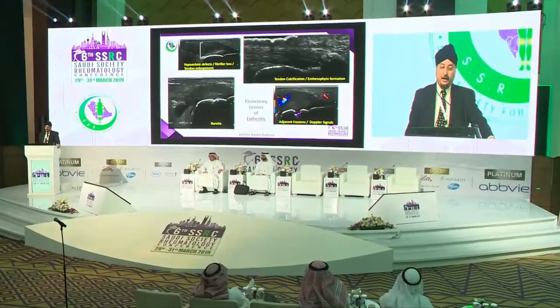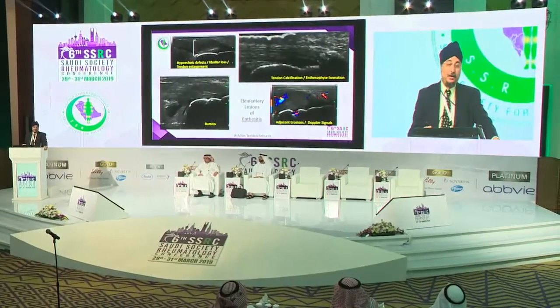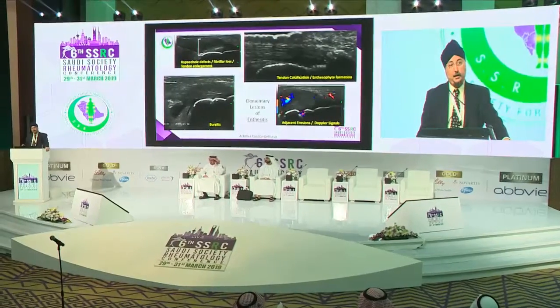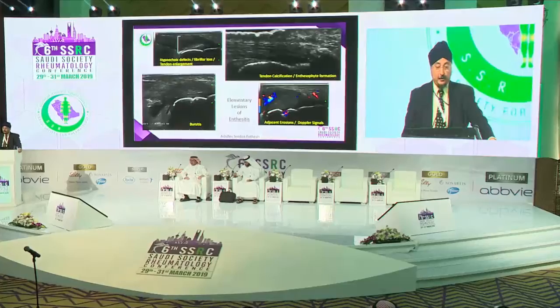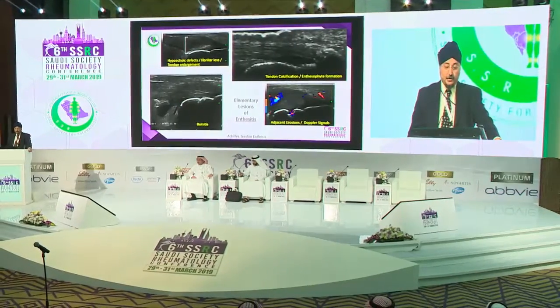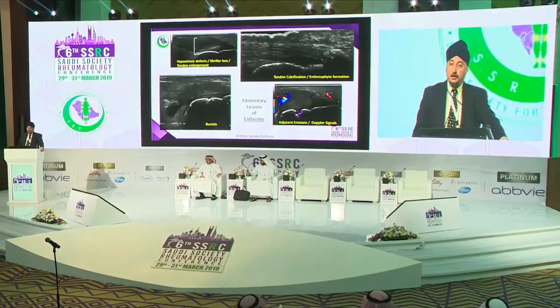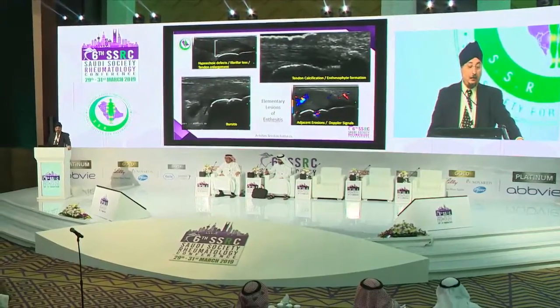So once we start getting these changes, we then start getting chronic changes, new bone formation. If the bone connects to the underlying enthesial bone, we call that an enthesophyte, and if it is within the tendon, it's intratendon calcification. We can also see problems with adjacent structures, such as adjacent bone might have erosions, and we can also see bursitis with these.